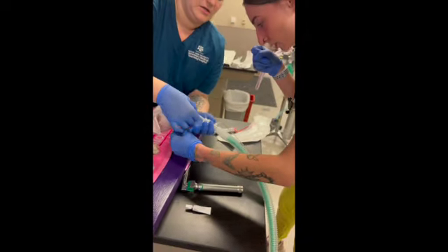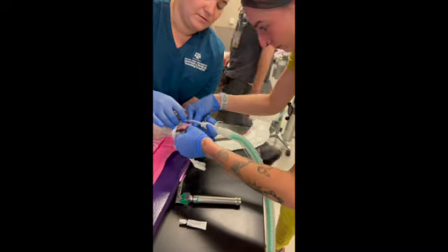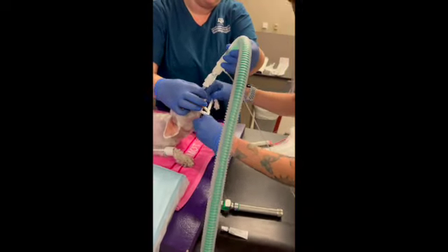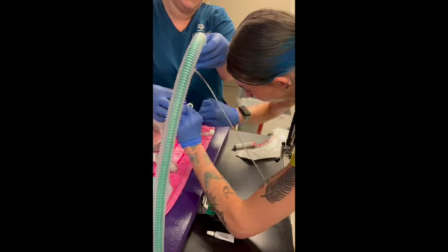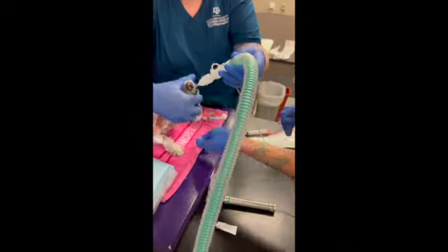Give me just a second. Sorry. Can I have one right now, but his tongue to the other side of his mouth? 45. Perfect. Sorry. Don't apologize. We'll make sure his tongue is not in that gauze before you really cinch him down. Beautiful. Small gauze. Alright, full.